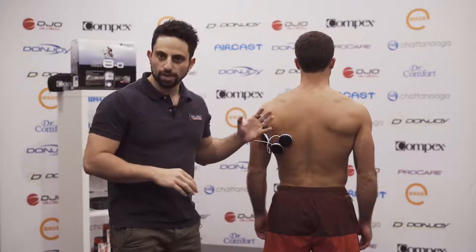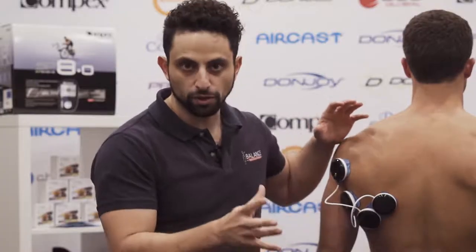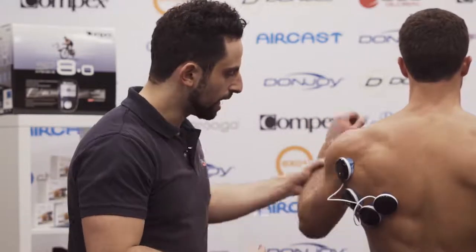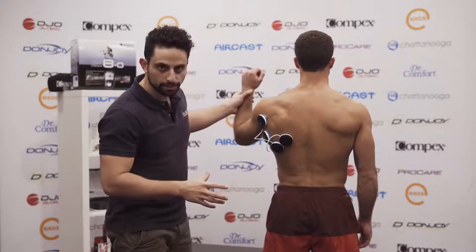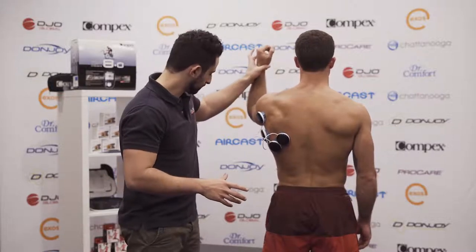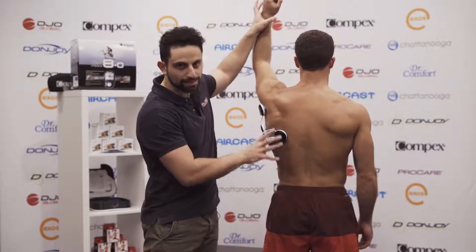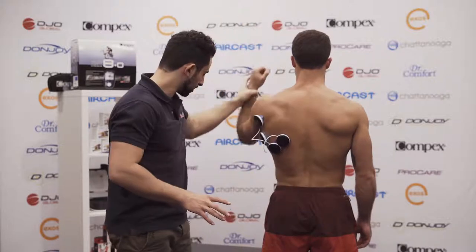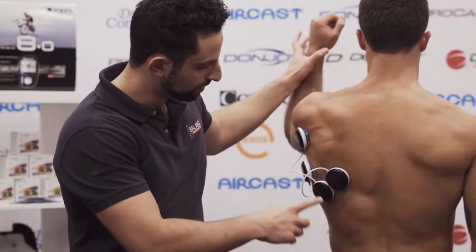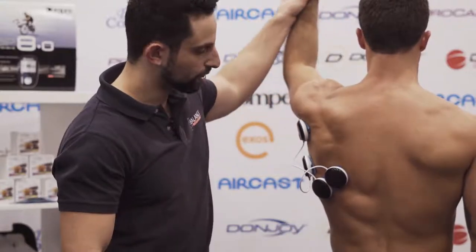What we've got here is a basic application of the Compex unit on the lat, so that when we have the arm in a position where we can get someone to press, it can then start to fire. It will contract as he pulls down. We'll wait for the next contraction and press, and you can see that the lat is firing and pressing at the same time.